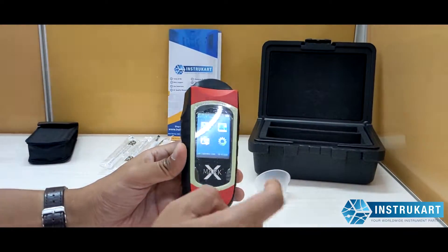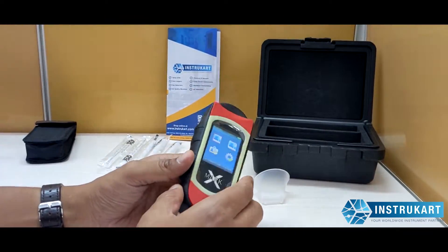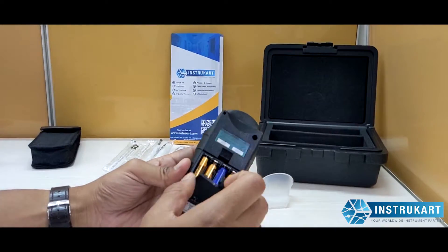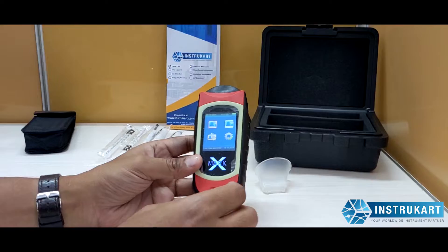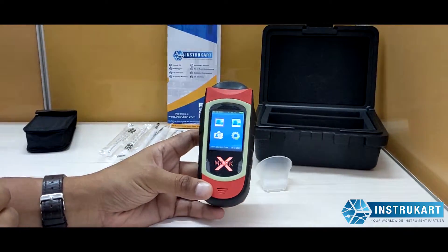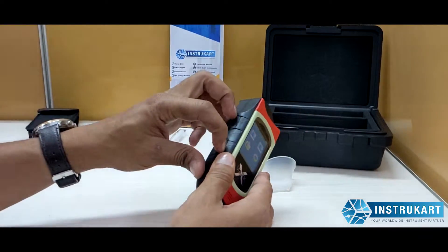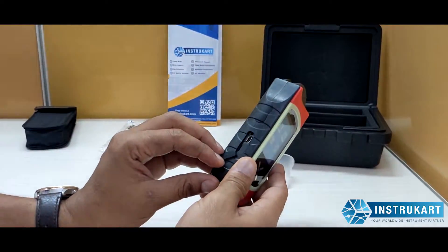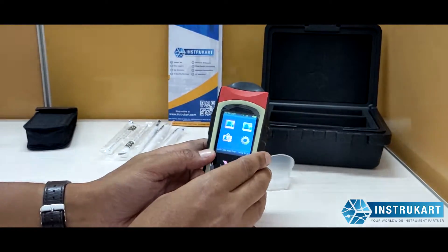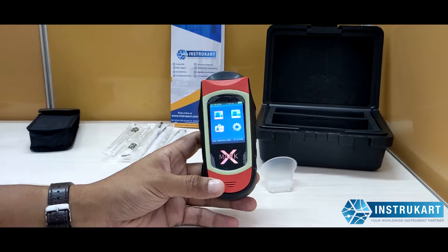It features a big TFT screen, 2.4 inches as you can see, and takes triple-A batteries to run. To ensure the report is not tampered with, a printer option is provided so you can take the data directly to the connected thermal printer. It has units of measurement in BAC, or milligrams per liter.